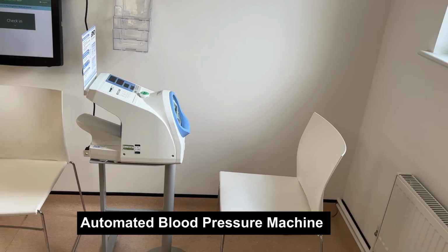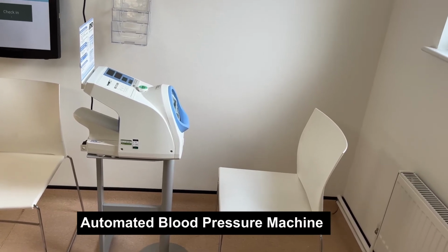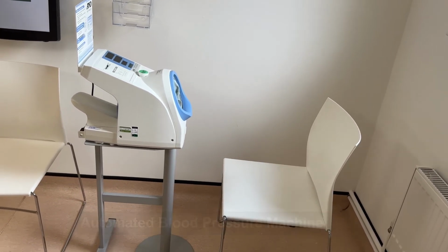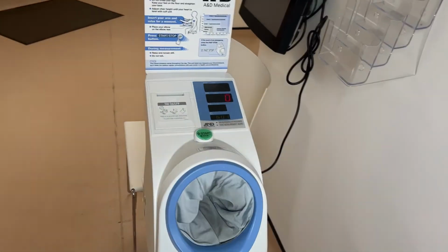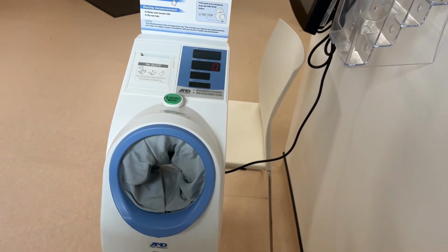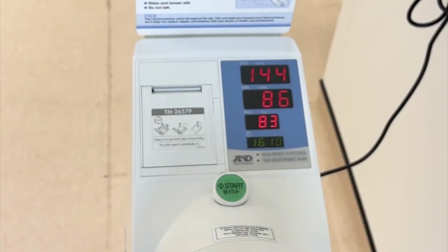So, this is our automated blood pressure machine. The hole in the middle is where the arm is going in. The start button on the top is where you are going to press to start reading. There are 3 numbers on the top to be aware of.